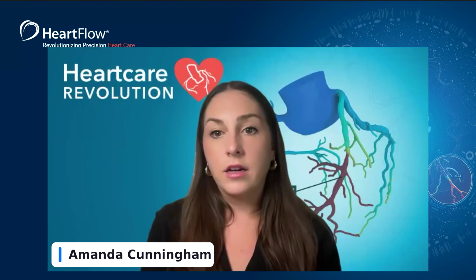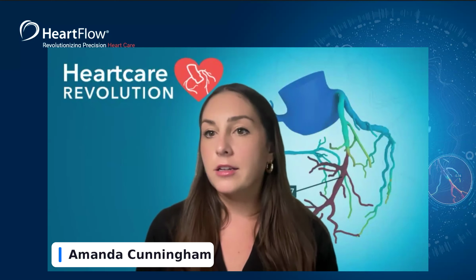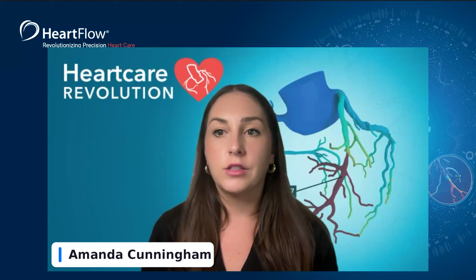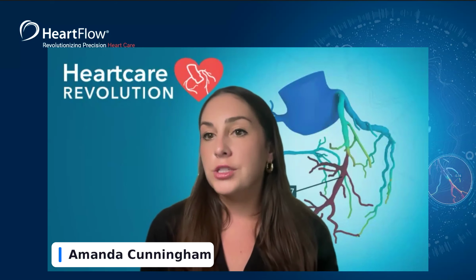So Amanda, they're adding on to this question and say, so minimal variability may still produce an acceptable scan, even if it's at 70 beats per minute. Is that a fair summary then? Yeah, I think exactly what Stefanie said. There's not an actual cutoff. It's really based on the physician, because they're the ones reading it essentially. So I would always just double check with them.